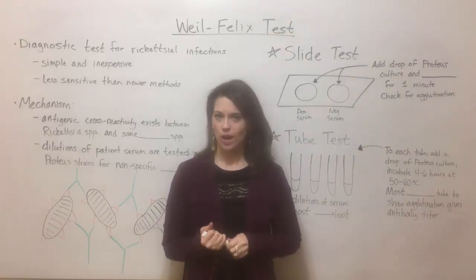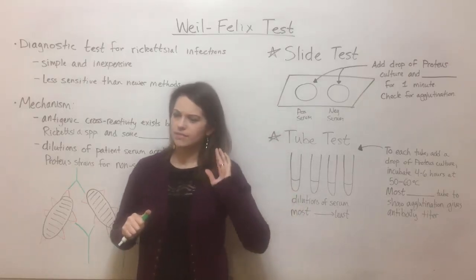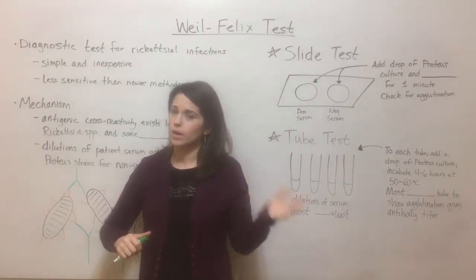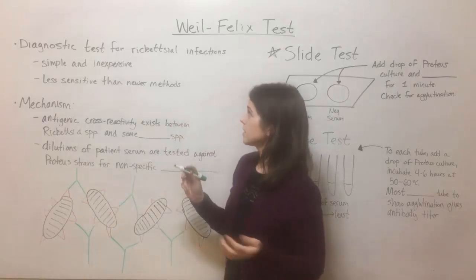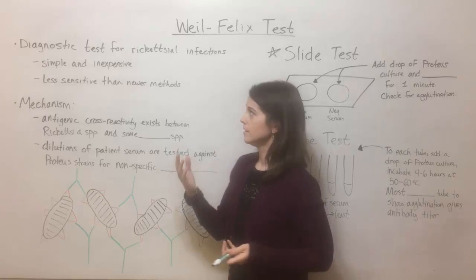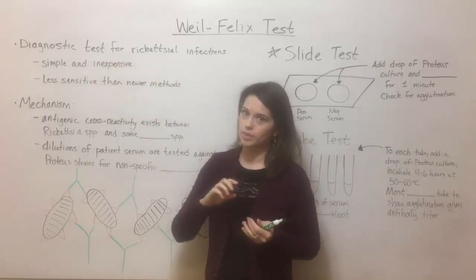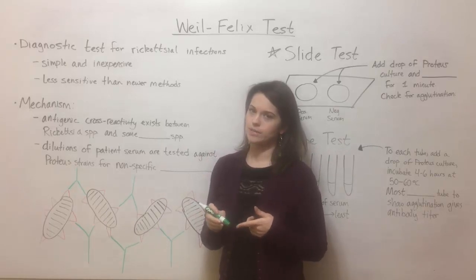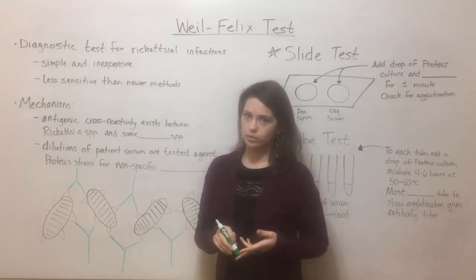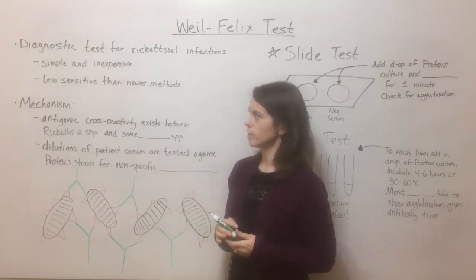Today we're going to talk about the Weil-Felix Test. The Weil-Felix Test was developed over 100 years ago by two scientists who realized that they could use a technique that they had developed as a diagnostic test for rickettsial infections. When we say rickettsial infections, we're talking about things like typhus and Rocky Mountain spotted fever. So infections caused by rickettsial bacteria.